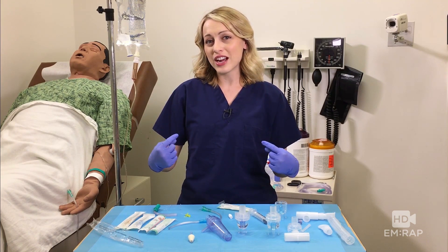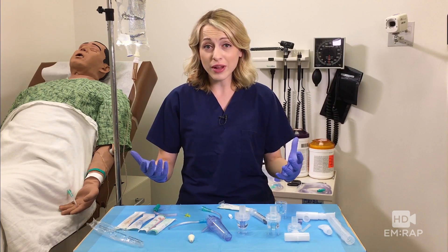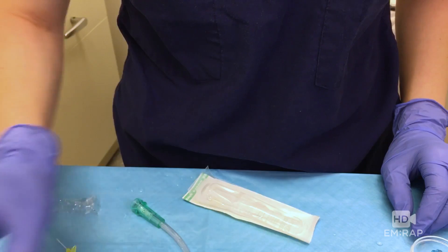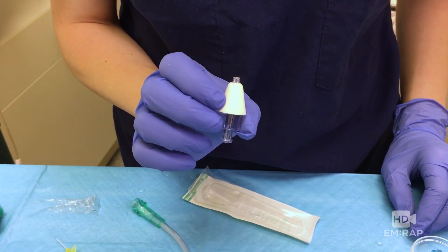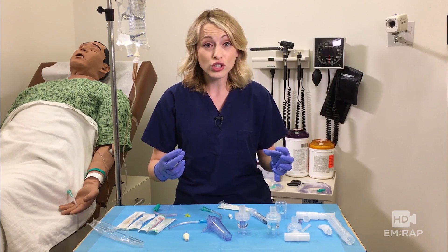What's up guys, Dr. Jess Mason here. The plan was to show you how to make your own mucosal atomizer device — very exciting. We were hoping to find a method that worked as well as the commercially available products. There are some other videos out there that show ways to do this using a nebulizer chamber.